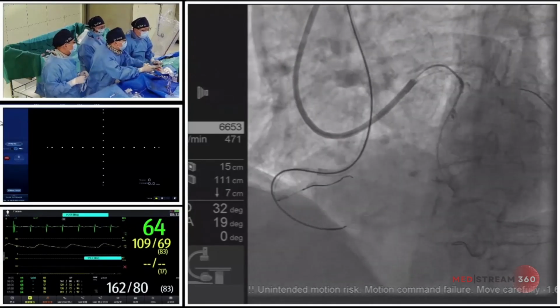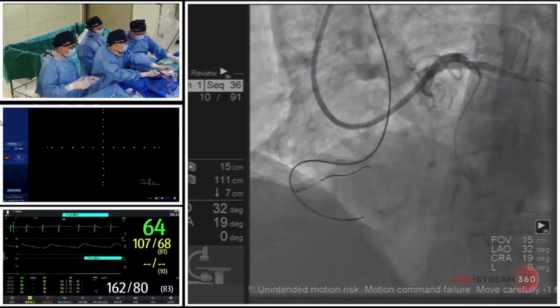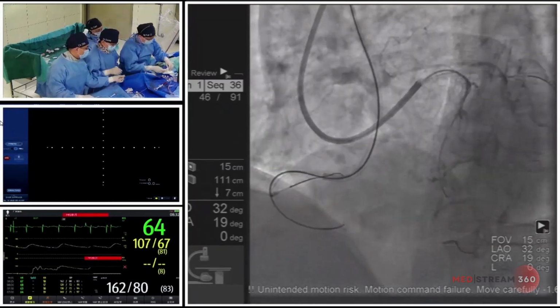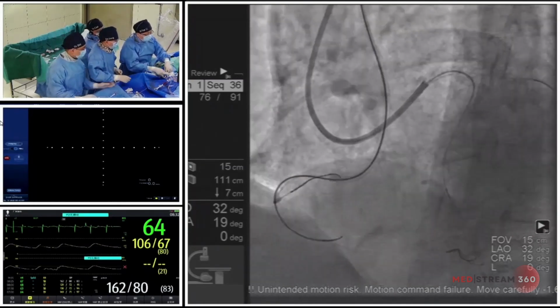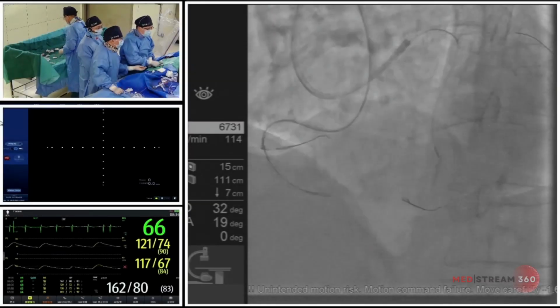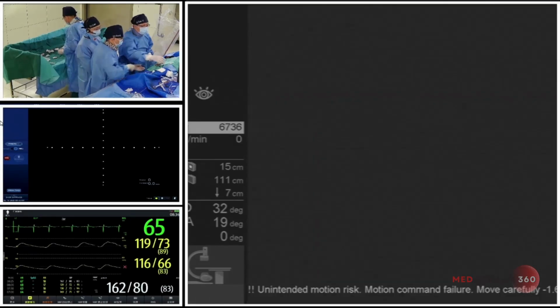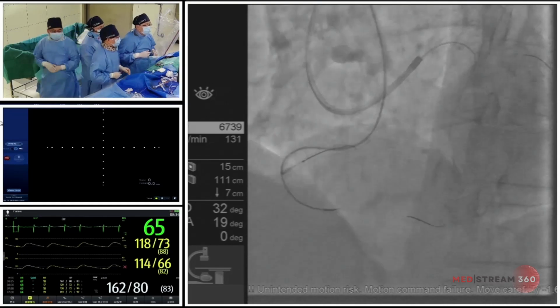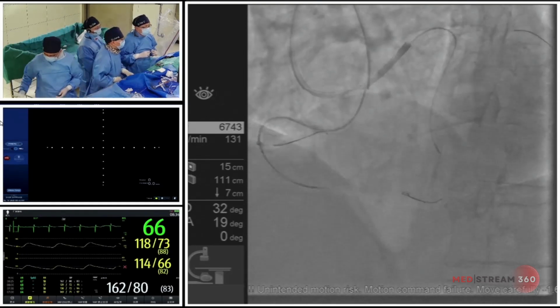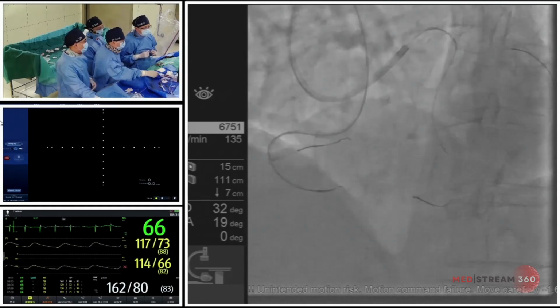Yes, this is of key importance, because we can see that after you perform the knuckle technique to cause some subintimal tracking, it is of key importance to avoid antegrade injection. So although there is some tortuosity, maybe we can try to use some small balloon to dilate the septal curve a little bit, to help the microcatheter to pass through.